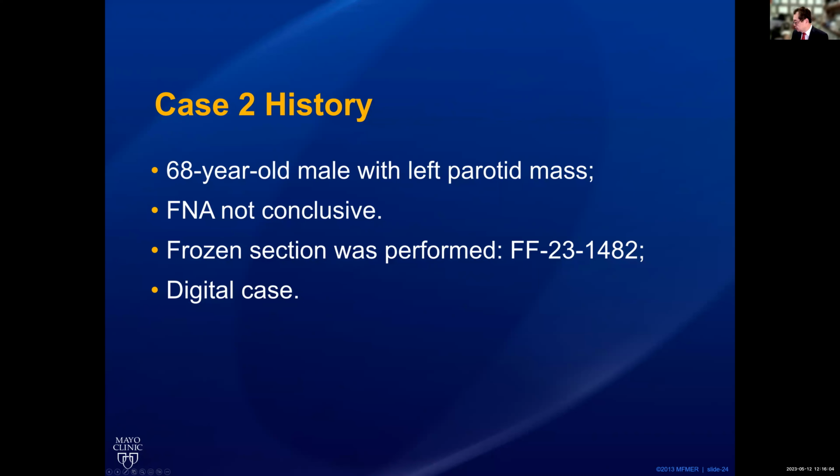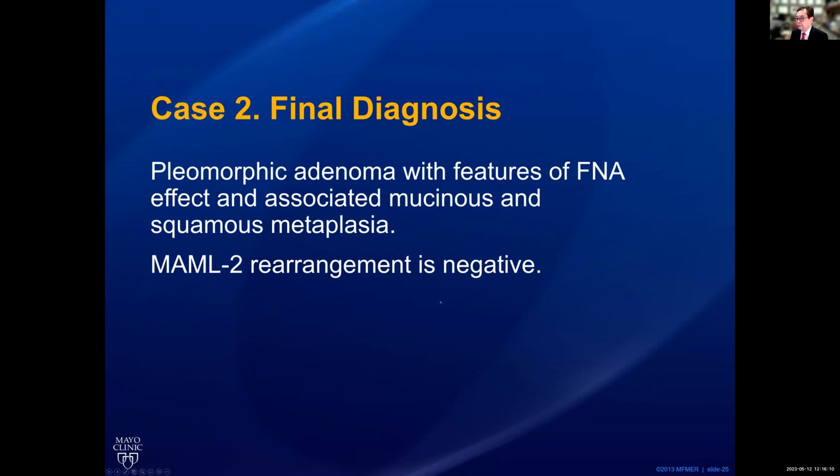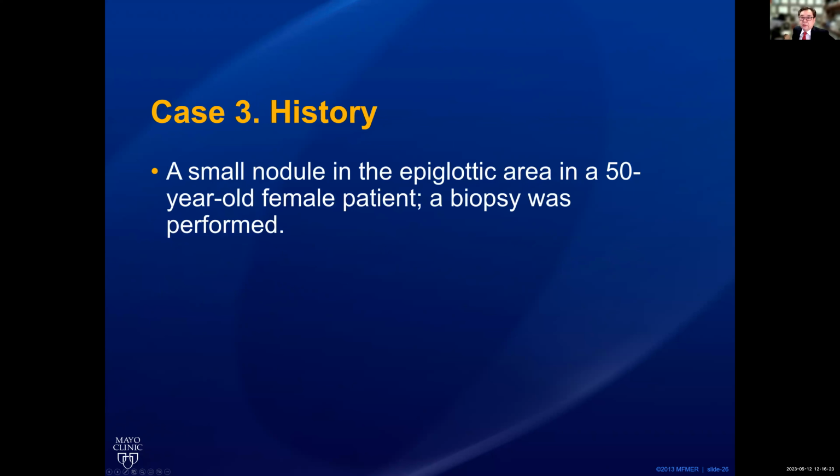So that's the case with digital demonstration, and this is the final diagnosis: pleomorphic adenoma with features of fine needle aspiration effect and associated mucinous and squamous metaplasia, and the FISH is negative. So that's another example that the FISH for MAML2 is used to help us.